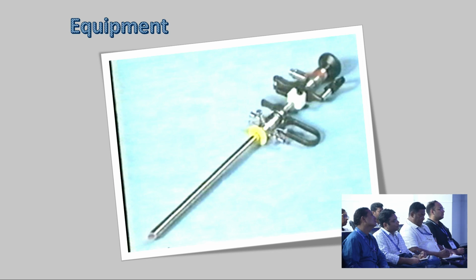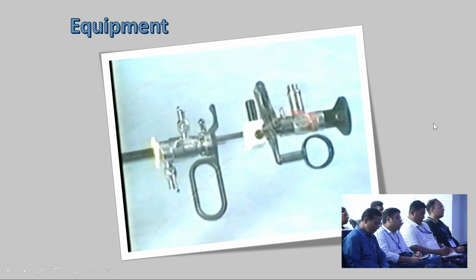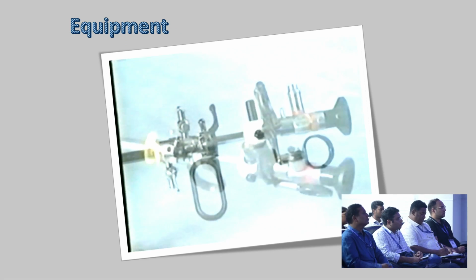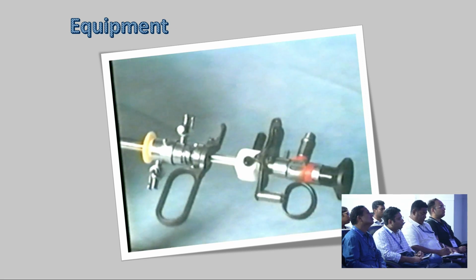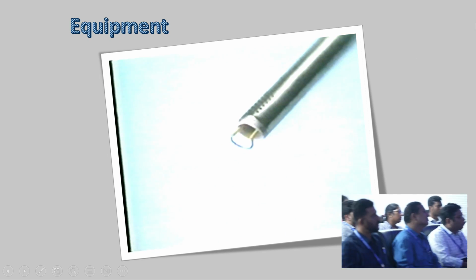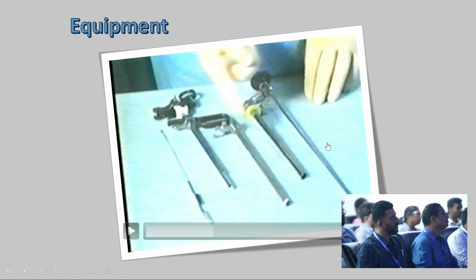Resectoscope, which we have just seen right now in the video. You see it assembled, completely assembled. And these are the 5 components.